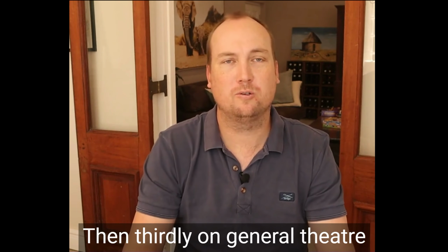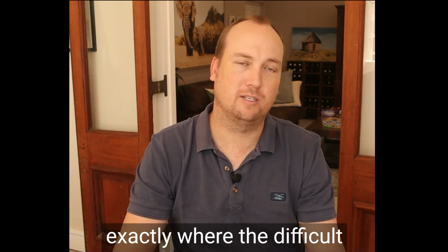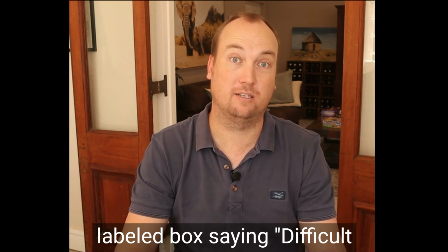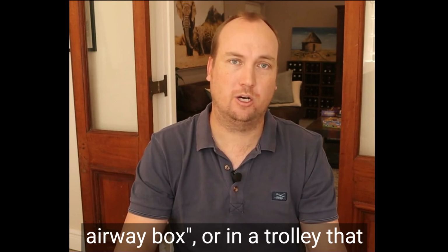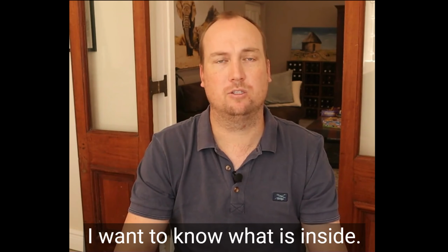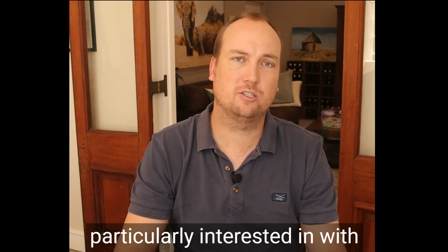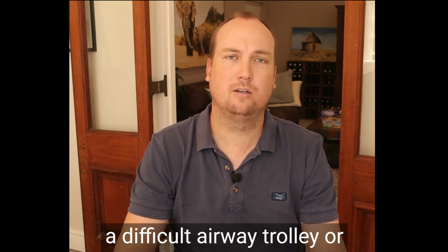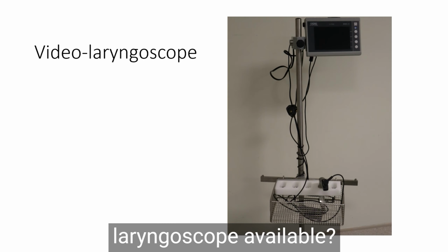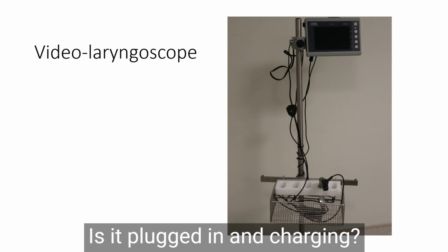Then thirdly, on general theatre preparation, I want to know exactly where the difficult airway equipment is kept. It should be kept in a clearly labeled box saying difficult airway box, or in a trolley that says difficult airway trolley. I want to know where it is, and I want to know what is inside. The three things that I'm particularly interested in with a difficult airway trolley: is there a video laryngoscope available? Where is it kept? What make is it? Is it plugged in and charging?